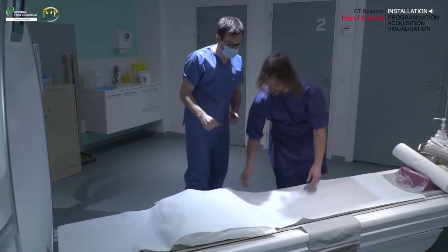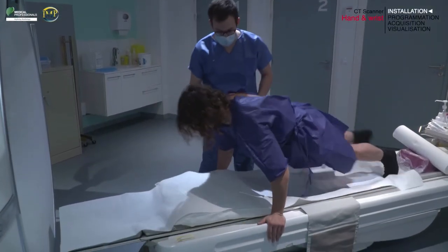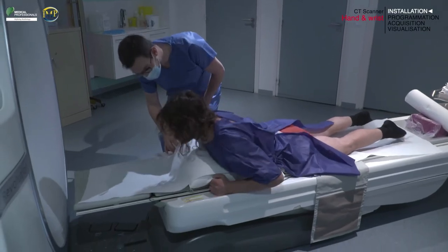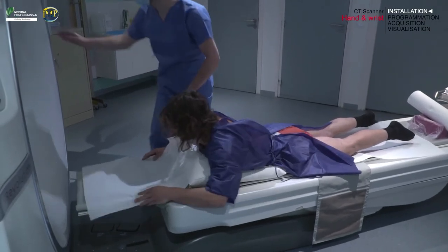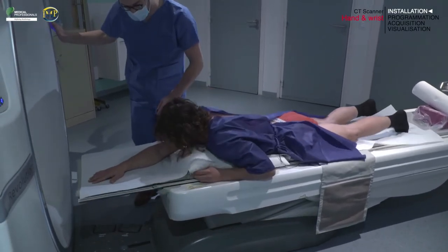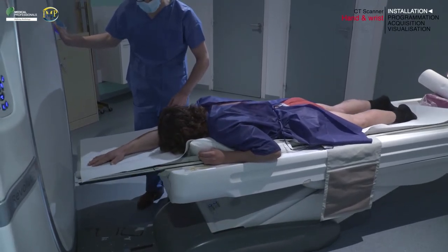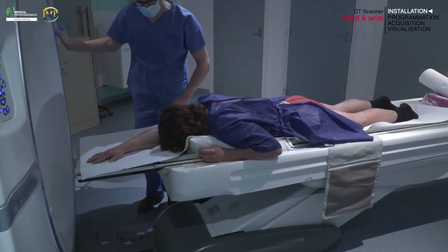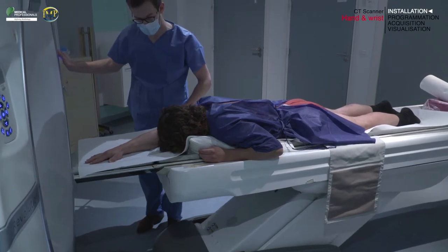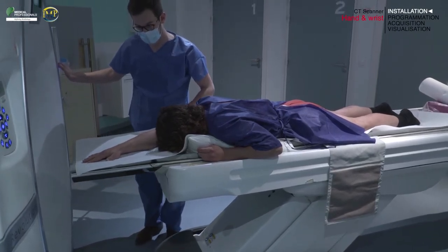After verifying the patient's identity using at least two identifiers such as first name, last name, and date of birth, place your patient in a prone position head first with the affected arm extended above their head and the opposite arm along their body or in a comfortable position.